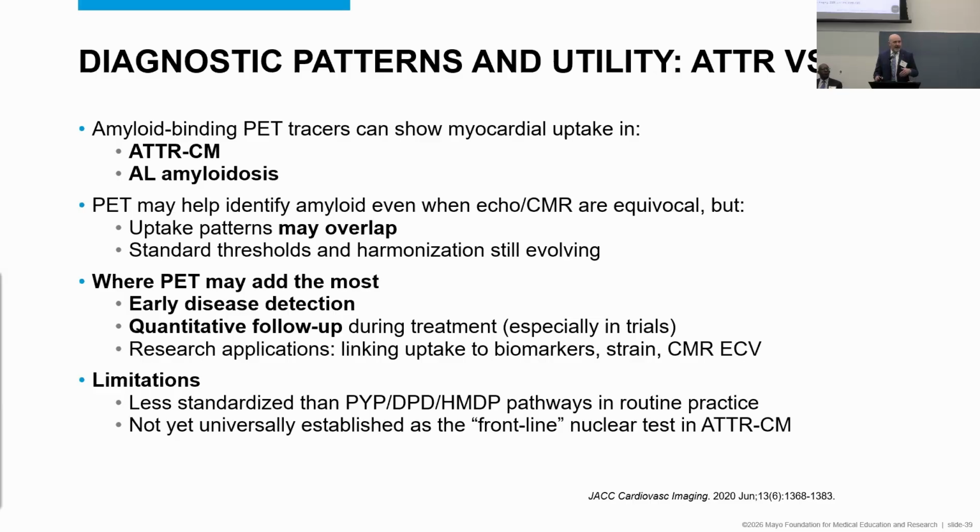The limitation, again, is that it's not universally available. It's not the frontline nuclear test for ATTR. The difficulty that comes up, and I know other individuals this morning were chatting about it, is access, right? If you have a tracer that's very specialized and only a few centers are going to offer it, that might not be the best option long-term for monitoring.